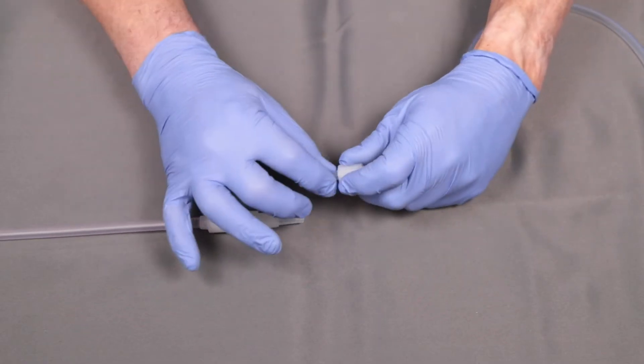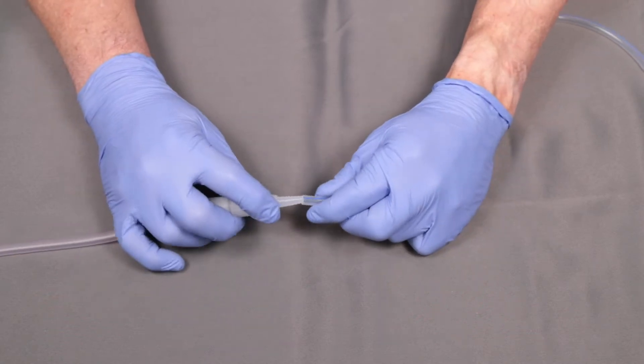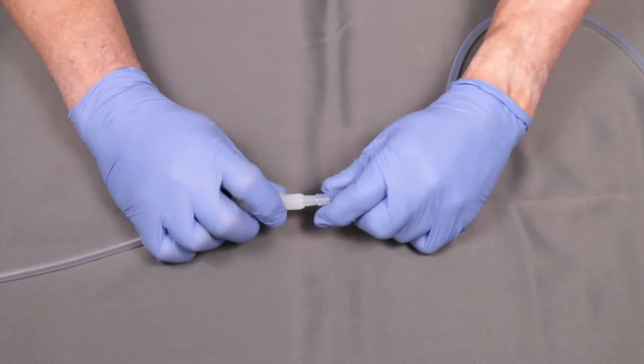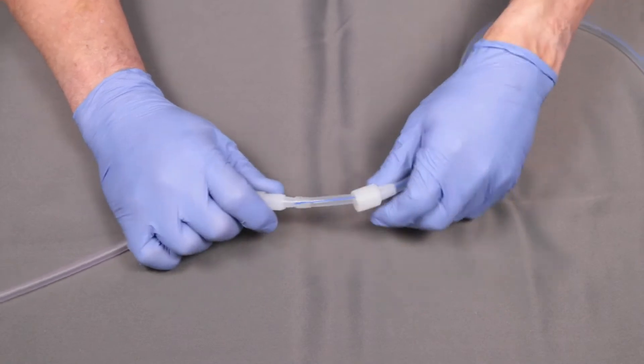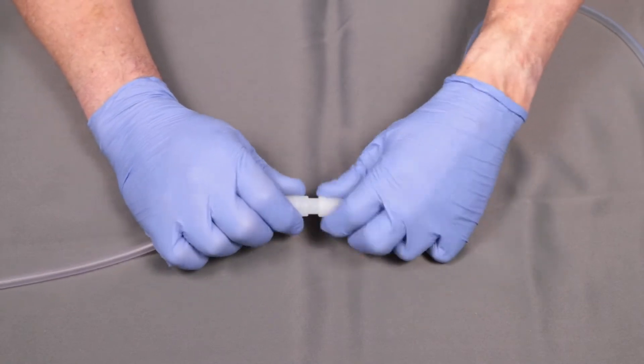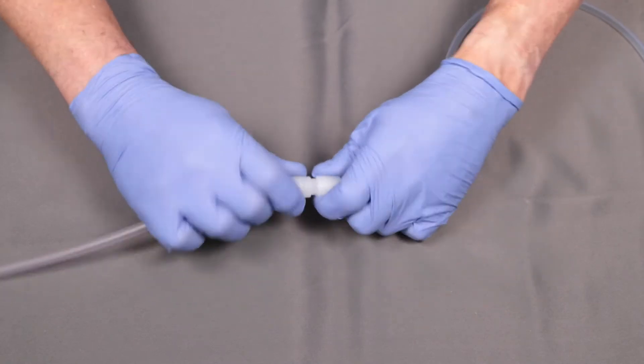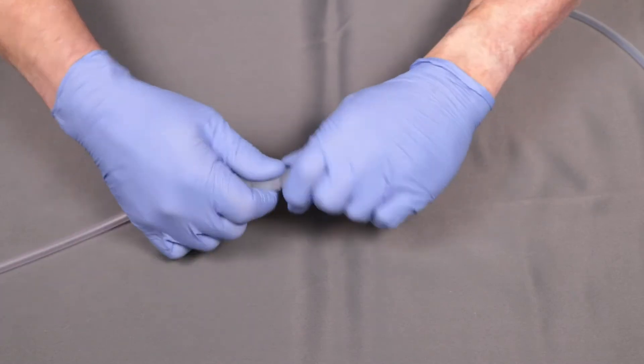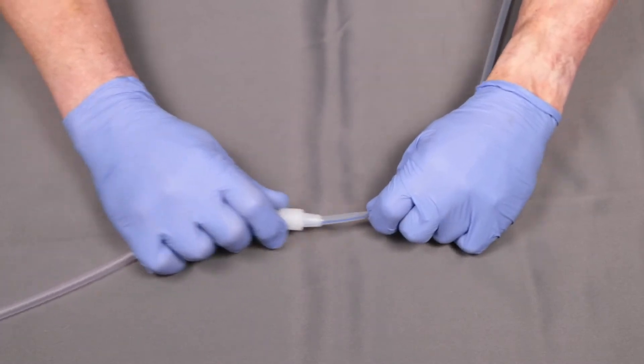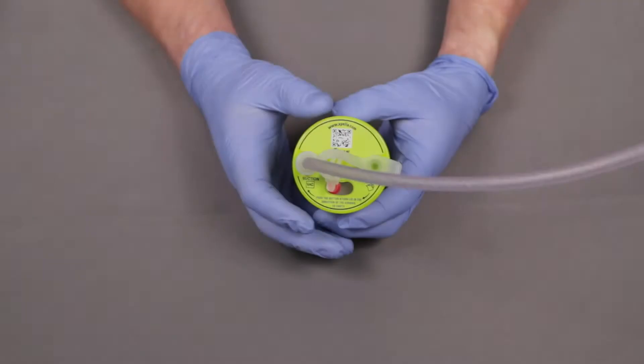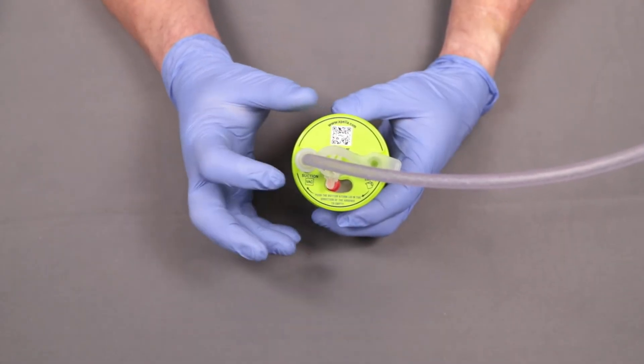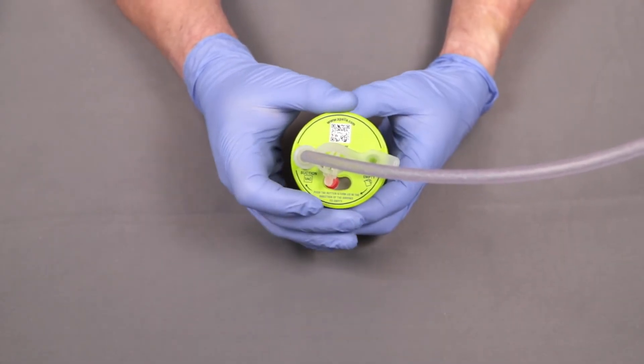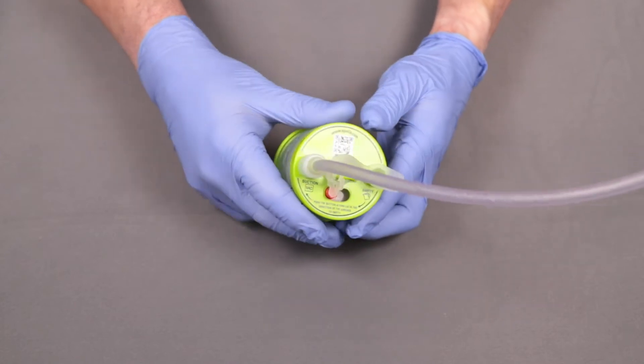Connect the Expeller Mini to the silicone drain. Make sure the red button is on vac. Proceed to activate the device.